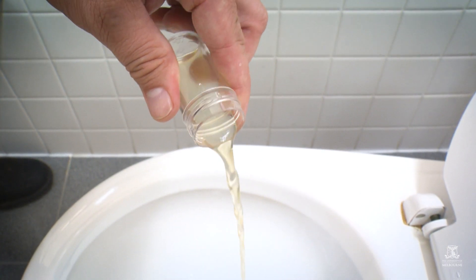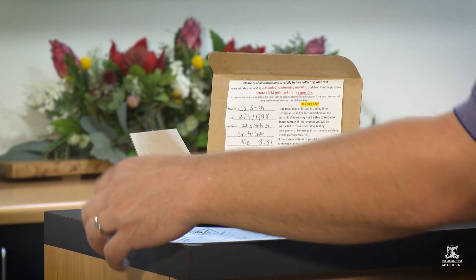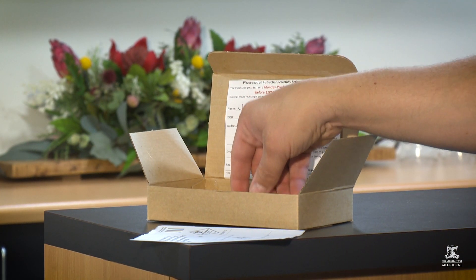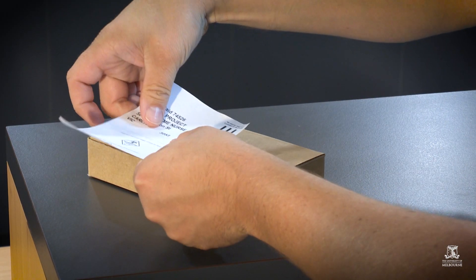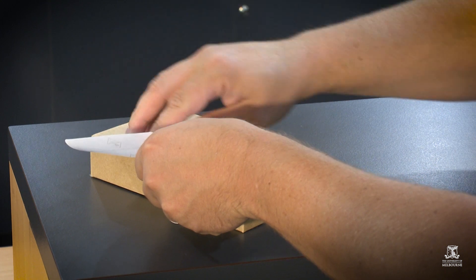Dump the remaining pee in the toilet. Wash and dry your hands again. Place the swab back into the cardboard box. Write your details on the form inside the box lid and use the addressed adhesive label to secure the lid closed.